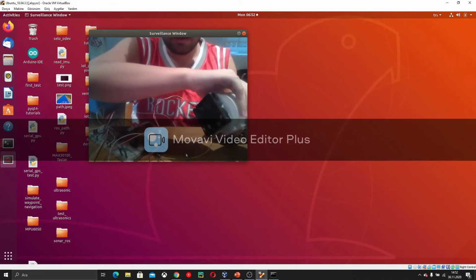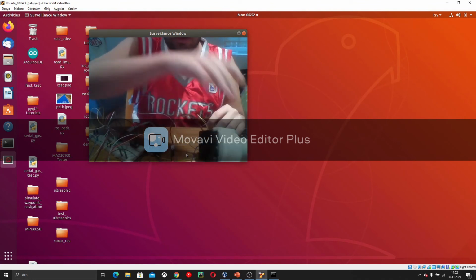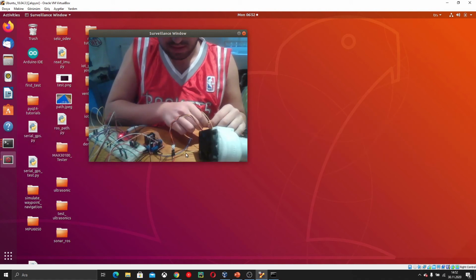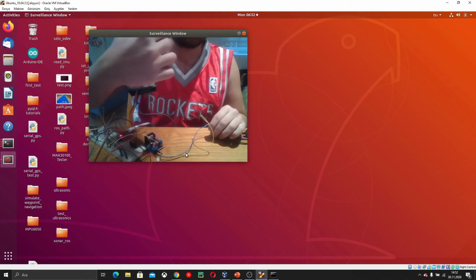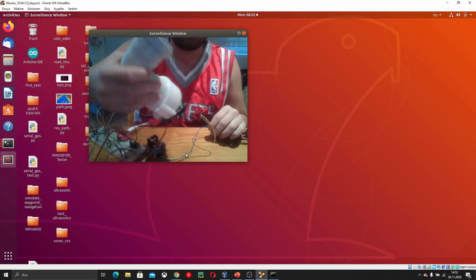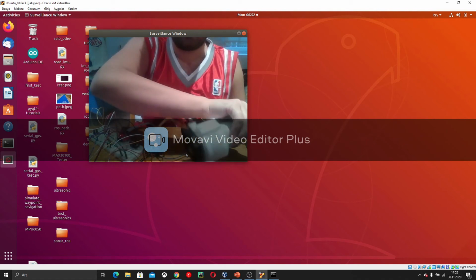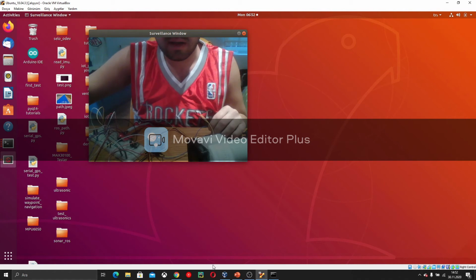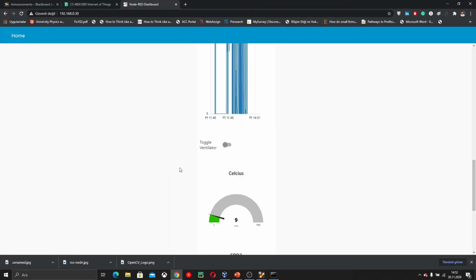Here's the fan and the role-playing ventilation machine, and when I put this here, as you can see, it works to imitate people's breathing. And again, you can just go down here and switch it off, and it works for the last time and stops.